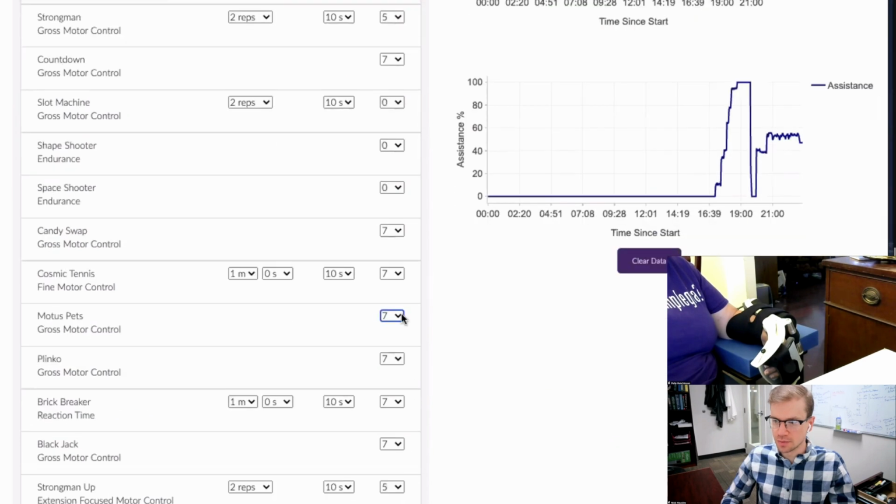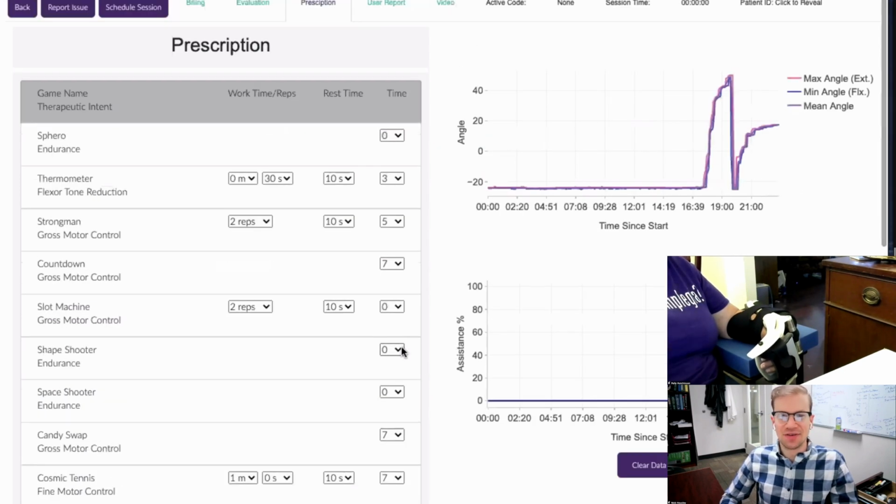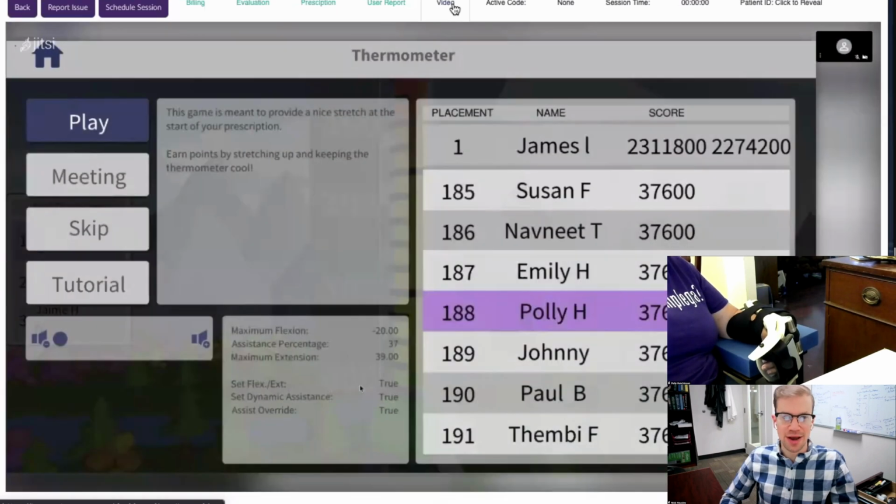Okay. Although, did you know Brick Breaker is right-handed? What do you mean by right-handed, Polly? If I have my right hand in front of me and I'm going into extension, that's to the right, and flexion is to the left. My left hand is opposite. I have to translate movement to the game. You have to do a little mapping in your brain, right, to reverse it. Yeah, I'm a true lefty. So that game is backwards.